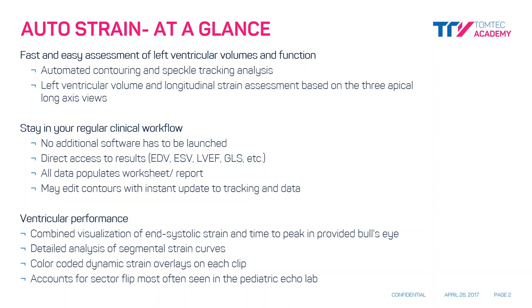AutoStrain provides direct access to results such as the end diastolic volume, the end systolic volume, left ventricular ejection fraction, and the global longitudinal strain. All data that AutoStrain provides populates our worksheet and in many cases can also populate the report. The user may also perform editing at any time of the initial contours with instant updating to both the tracking and the results.